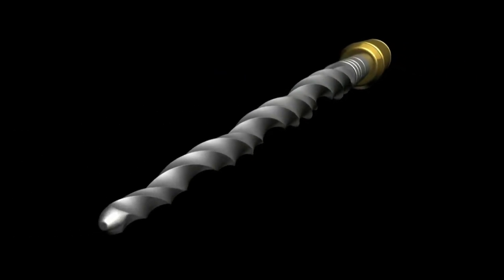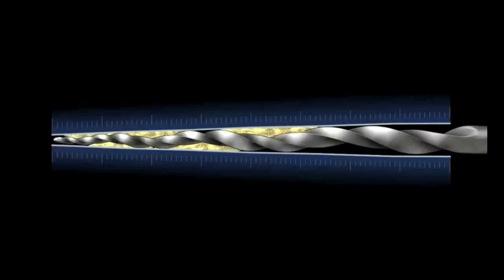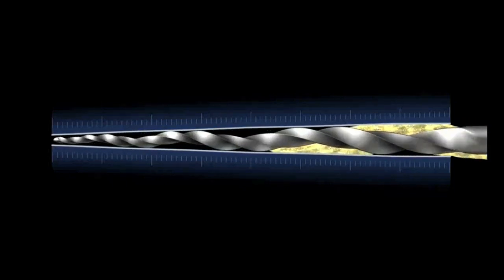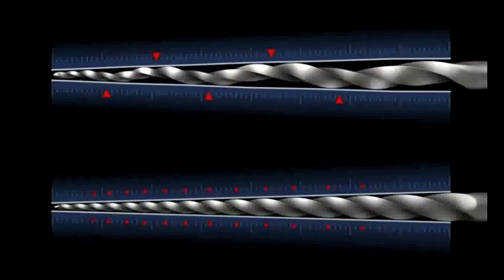Okay, let's leave the animation now and go to some SEMs of the instrument itself. And it looks different, doesn't it? You know that it's different, and you know what? It is different. If we now look at this one more animation of the effect of the asymmetric core, you can see that only 2 points are contacting at any given time compared to a fixed taper.